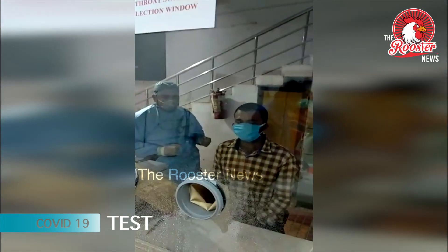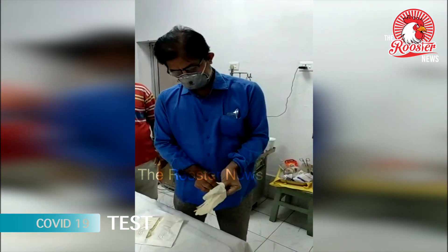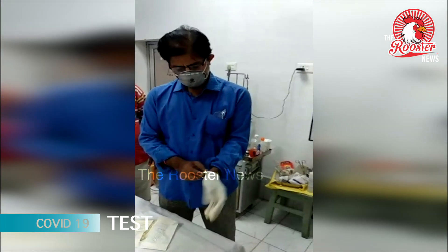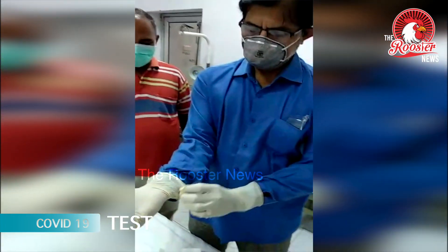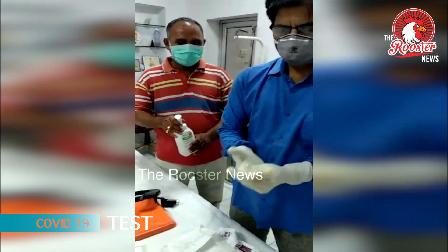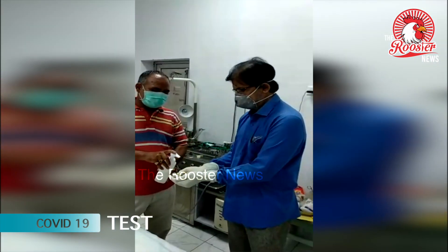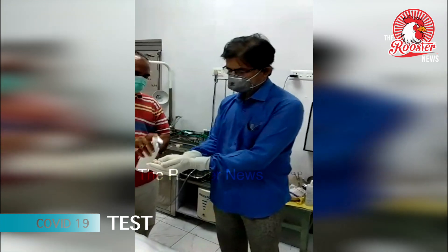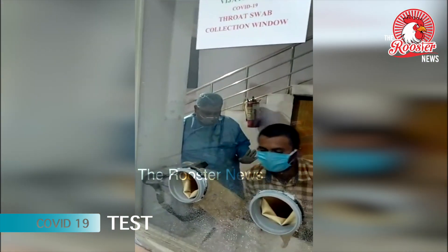This is the second case for which the sampling will be taken by Dr. Ravikant again. It's getting ready and almost ready. The hands are being sanitized with sanitizer. The patient is also ready, and the area has been sprayed another time.